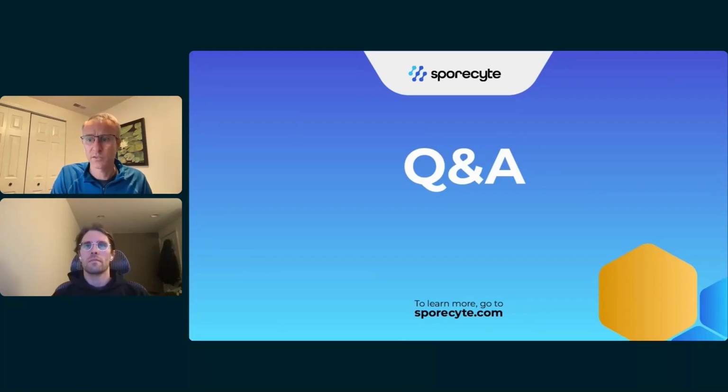There's another related question from Alex, which says, how do you know the AI won't make things up or make a mistake? I'll talk about that in a couple of ways. Because our algorithm is really just detecting, identifying, and classifying objects, we can test it very thoroughly. Another thing to know about ChatGPT is it's called a generative model, which means it produces new content. Our models produce identification of objects on the slide, but they're not generating images of those objects. They're not trying to generate other content, whereas the large language models do.